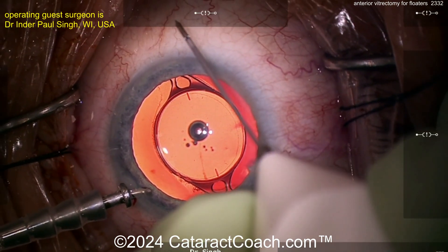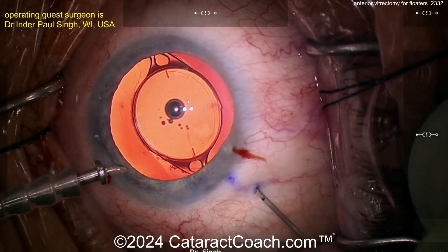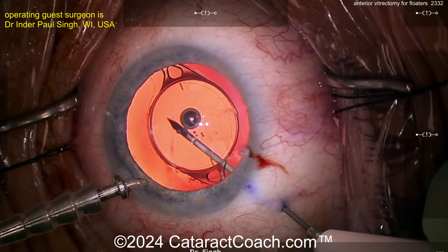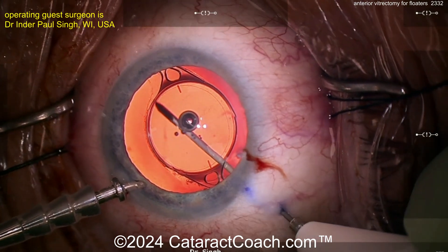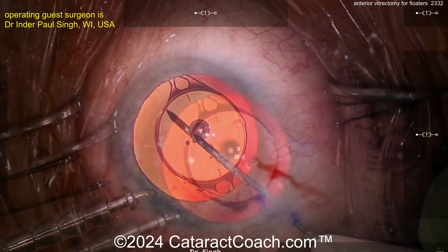I'm going to enter perpendicular to the sclera towards the posterior pole — enter with conviction. You're going to see a little resistance, that's normal. See how it enters pretty nicely? We go right behind the lens, maybe a few millimeters behind the lens. You can see in the anterior-middle vitreous all those opacities.